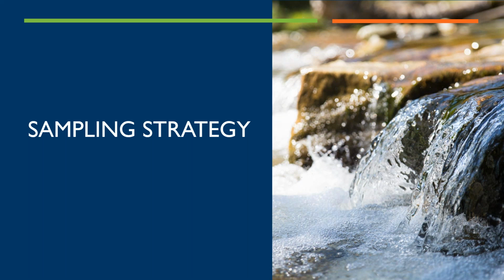Okay, thank you, Sam. So once you're ready to move forward with an analysis, it makes sense to devote some time to planning your sampling strategy. This can mean thinking ahead about how you plan to use the results and making sure that you're collecting enough samples from the right locations to aid your interpretation so you'll be able to draw some strong conclusions. This could also include some very practical concerns about what supplies and equipment you'll need at the site and how often you should plan on shipping samples back to the lab.